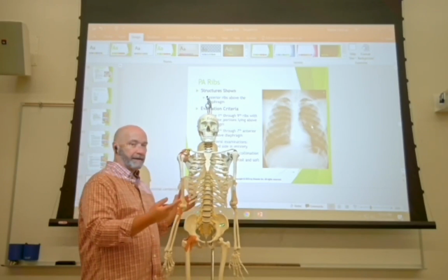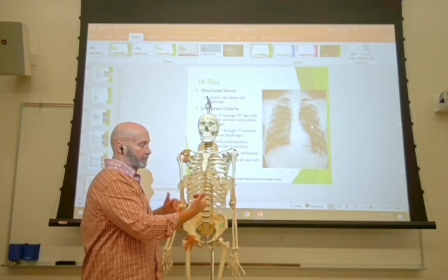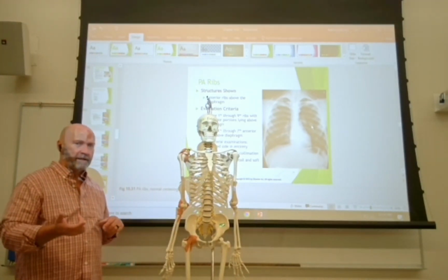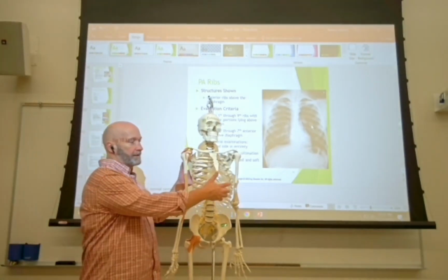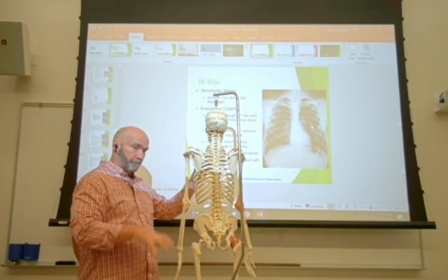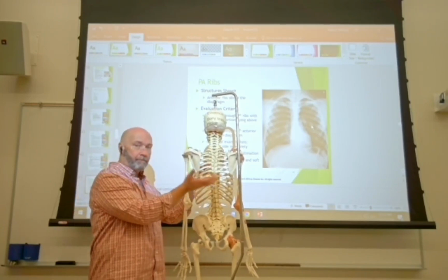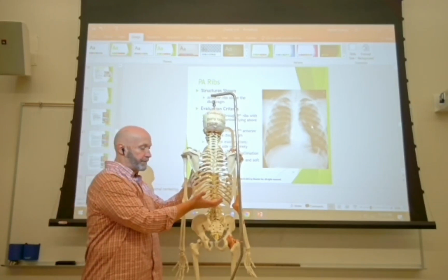So in order to make sure that we see the entire rib, and see it clearly, we're going to shoot two different APs. We're going to shoot one for all the ribs above the diaphragm, and then one for all the ribs below the diaphragm. So for the ribs above the diaphragm, your breathing instructions are going to be just like for a PA chest x-ray, and that is to take in a deep breath and hold it. Have them take in two if you can get them to. Take in a big deep breath, hold all the way up, take in another big deep breath and hold it, and that's going to depress the diaphragm as low as it can so that you can get as many ribs above as possible.